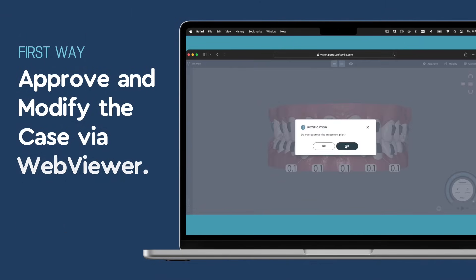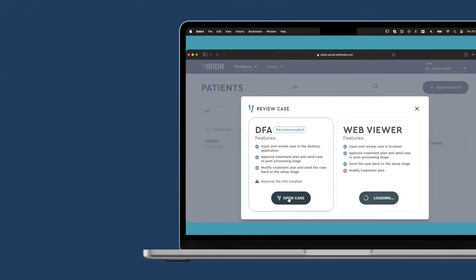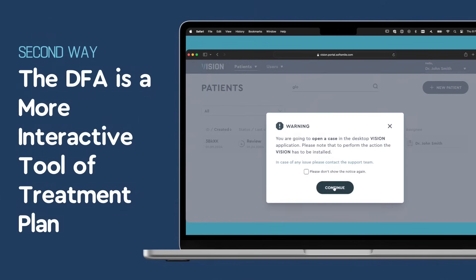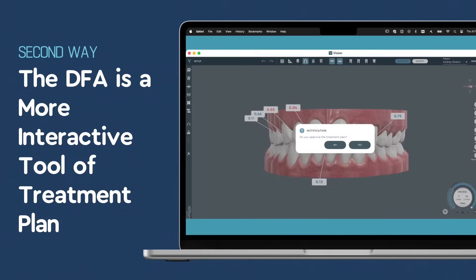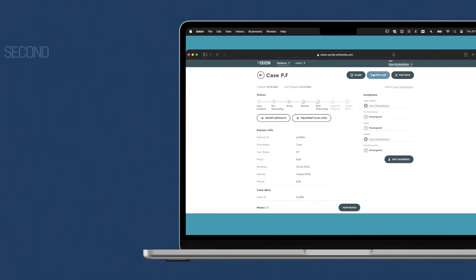Approve and modify the case via WebViewer easily. The doctor-facing application allows you to simulate treatment outcomes and make real-time adjustments.